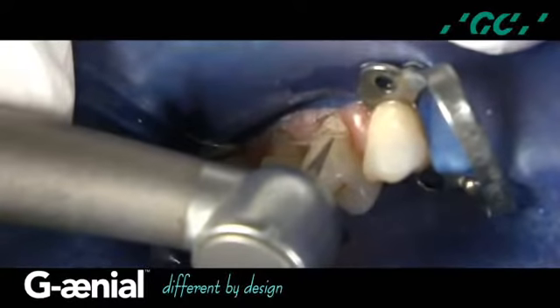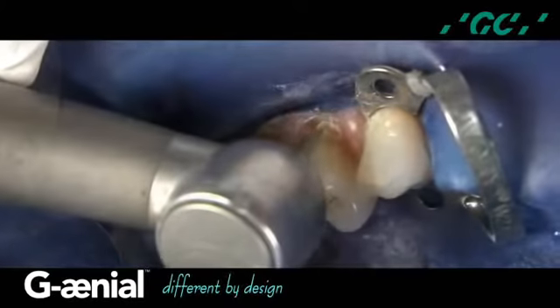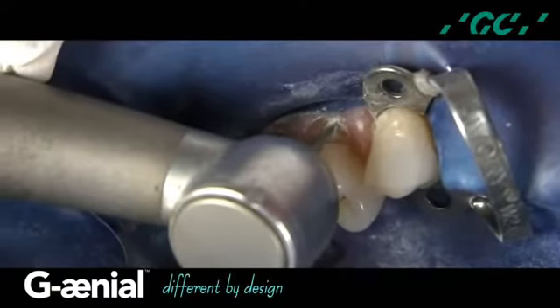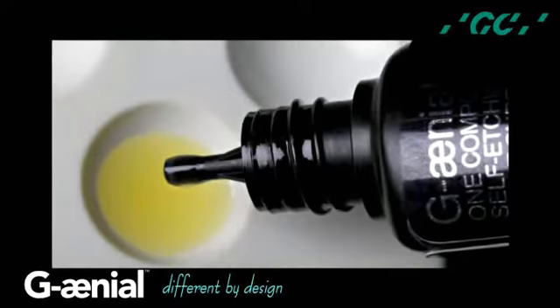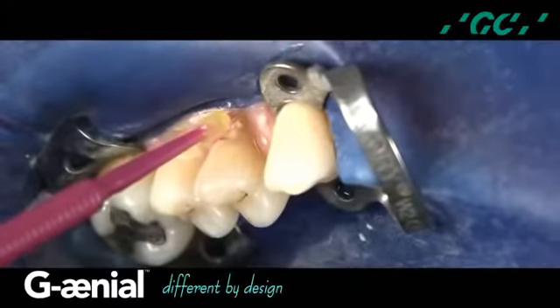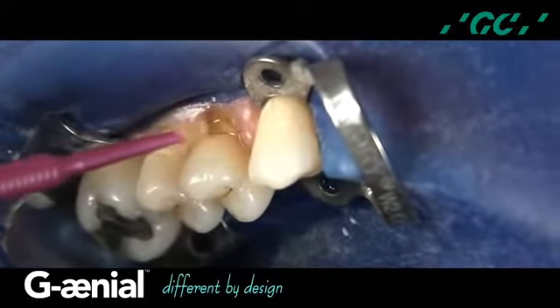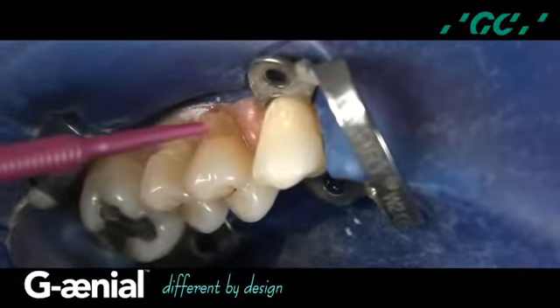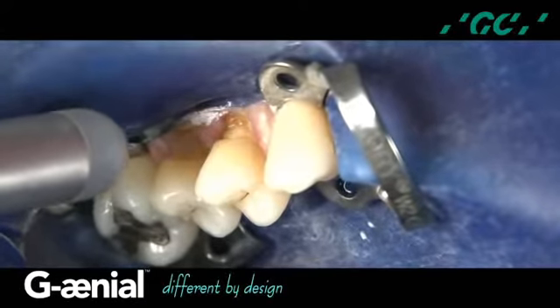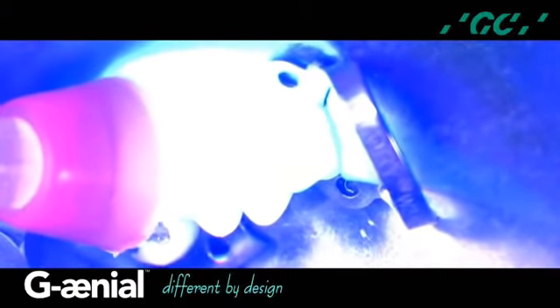A 0.5 millimeter bevel is placed in the enamel around each cavity preparation to reduce the potential for microleakage. A self-etched adhesive, Gineo Bond, is applied to the enamel and dentin of each preparation with an applicator tip, allowed to dwell for 10 seconds, air dried with a warm air tooth dryer for 5 seconds, and light cured for 10 seconds.